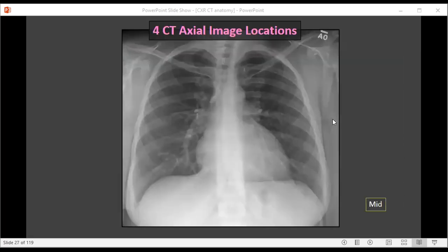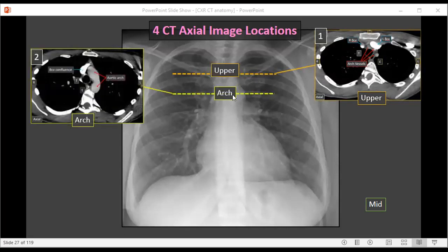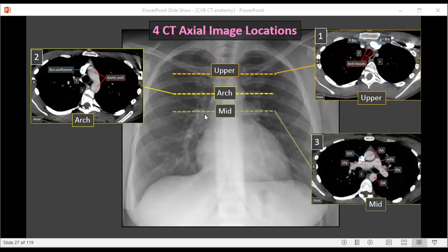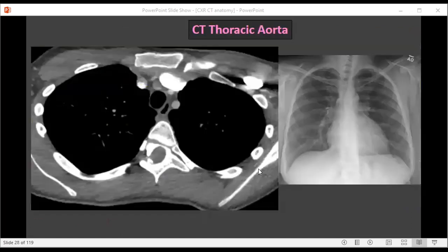Now let's take a look at the four axial CT image locations we're going to be studying. The first is going to be in the upper chest, around the level of the clavicles, where we expect to see the arch vessels. The next level is at the level of the aortic arch, where we expect to see the aortic arch. Then in the mid chest, just above the heart. And lastly, in the lower chest where we expect to see the heart.